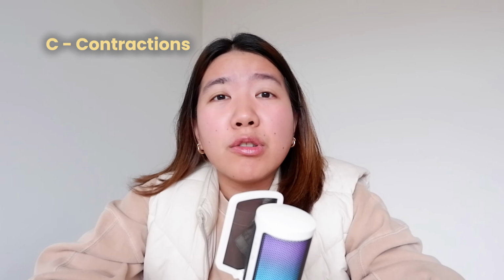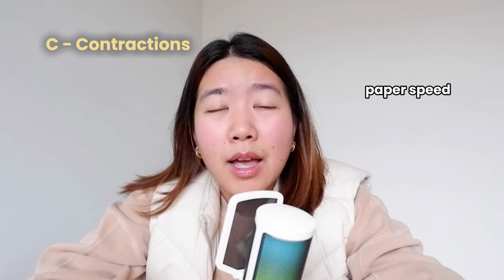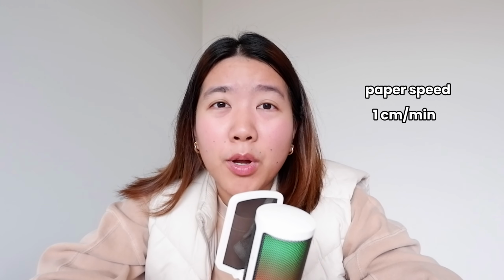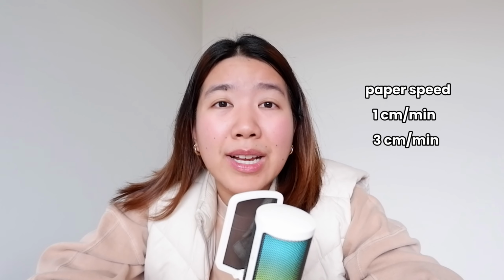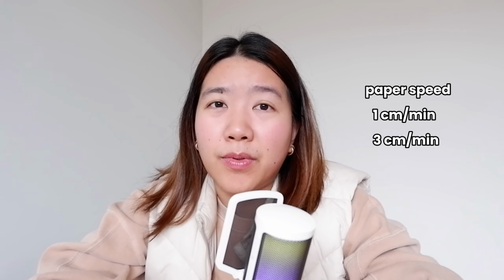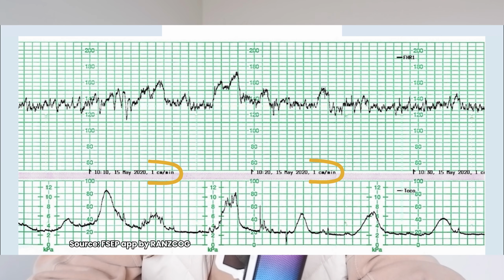Contractions. Before you start looking at the contractions or interpreting the CTG, make sure that you check the paper speed first. Many hospitals use 1 centimeter per minute, which is more common, but some hospitals use 3 centimeters per minute. So make sure that you are aware and you check that before you read anything else. Then when you check for the contractions, they will be at the bottom part of the CTG, as you can see here.